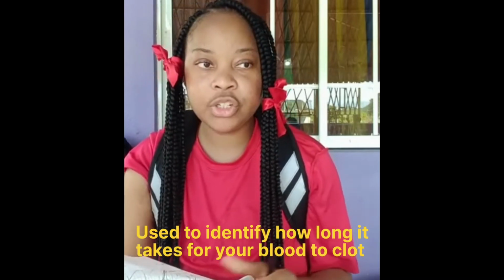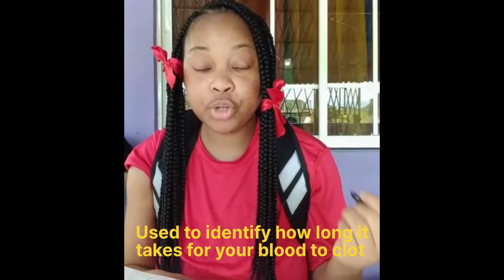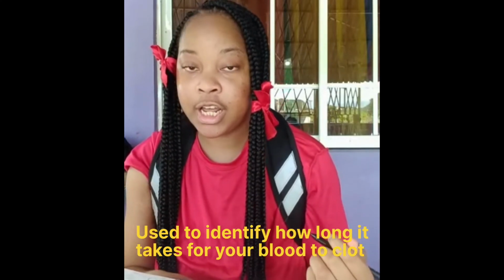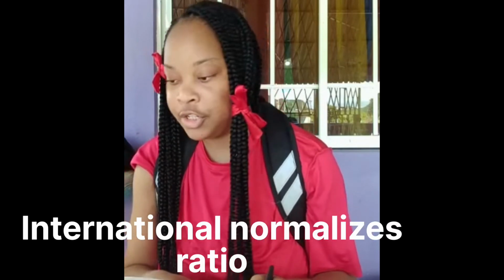It measures how long it takes for your blood to clot. It checks for bleeding problems. It also checks whether or not medication helps for blood clots. PT can also be called INR, that's International Normalized Ratio.